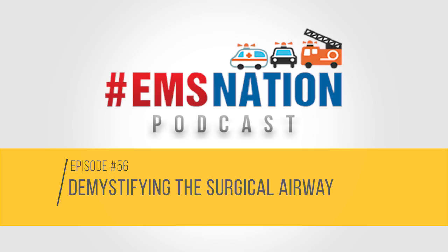Chris, you and I recently recorded a training video for the New York State Collaborative Protocols on finger scalpel Bougie for the surgical airway. Yes, and I think that education, practice, rehearsing, even rehearsing in your own mind is extremely important. And I think that helps to, quote-unquote, demystify this procedure, as Kevin mentions. I think that the procedure itself is relatively straightforward, but when you have to do it, you really want to ensure that you are not hesitating when you need to manage this patient's airway. After all, this is a patient whom you cannot otherwise ventilate or intubate.